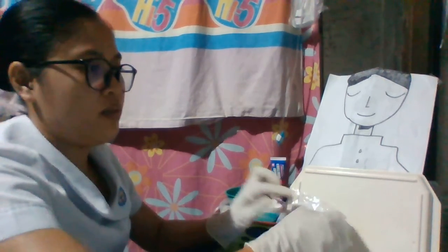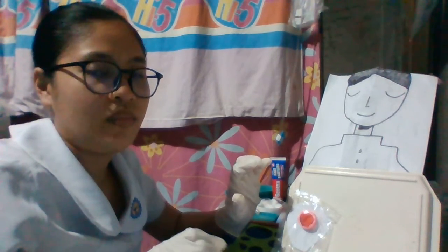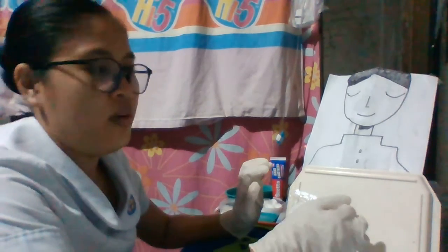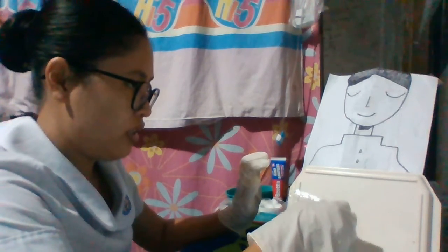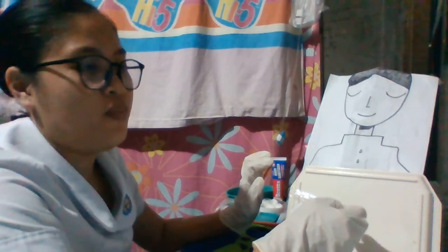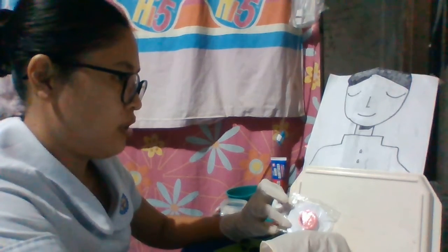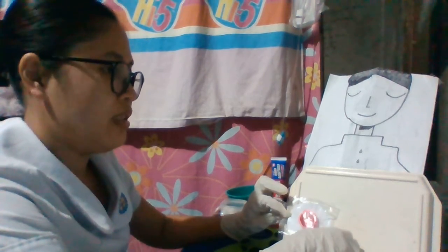And next, we can apply hypoallergenic tape as needed to each side of the faceplate over the skin barrier. Some pouches are manufactured with tape in place.